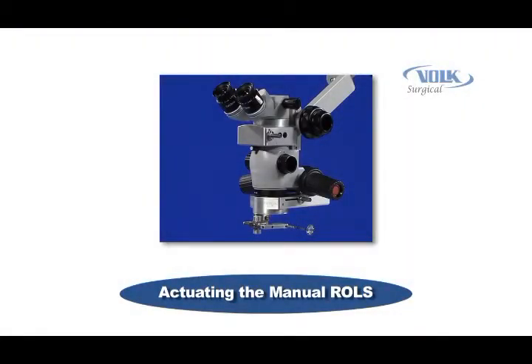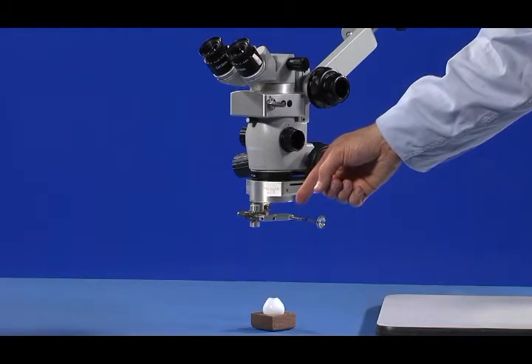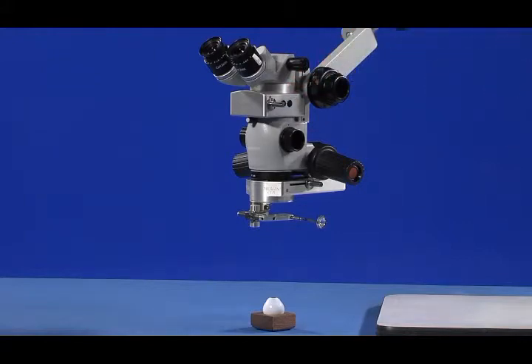Actuation of the manual Rolls Infinity is also extremely easy. When the LPU is switched between its up and down positions, the Rolls Infinity prism is moved to its appropriate location using the sterile handle.